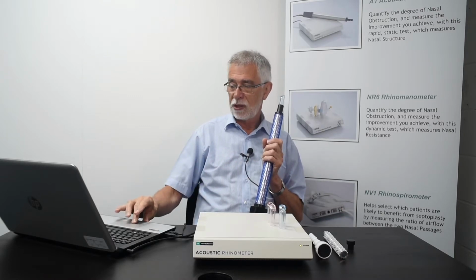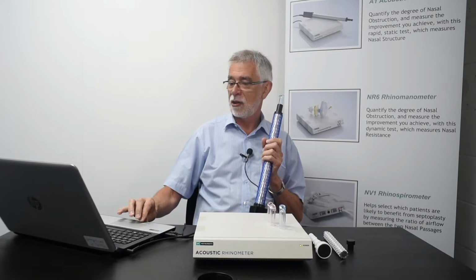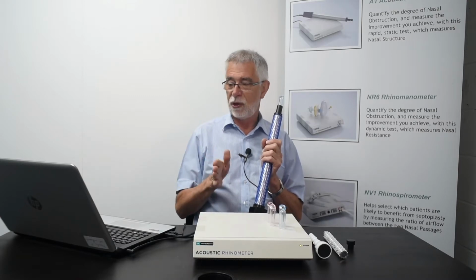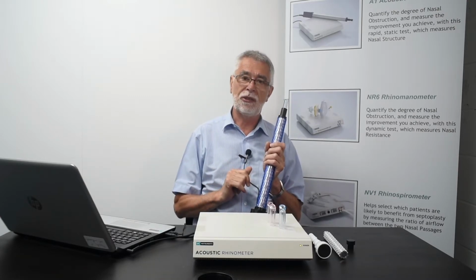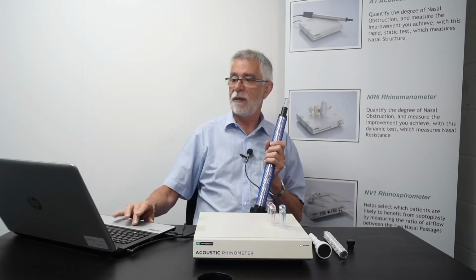The information at the bottom of the screen allows you to determine how severe the obstruction is for min 1 and min 2, and also to measure the volume between 0, the starting point of the nose, and 5 centimetres into the nose. That was a measurement for the left side.